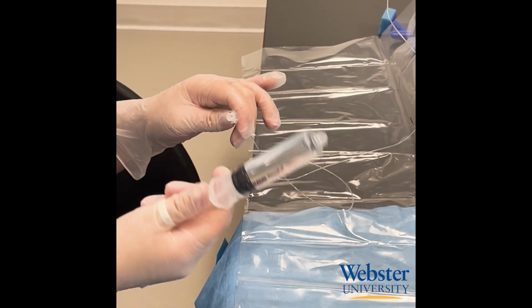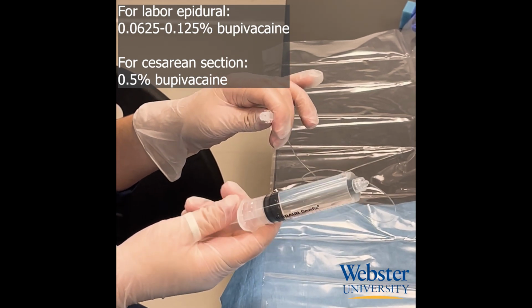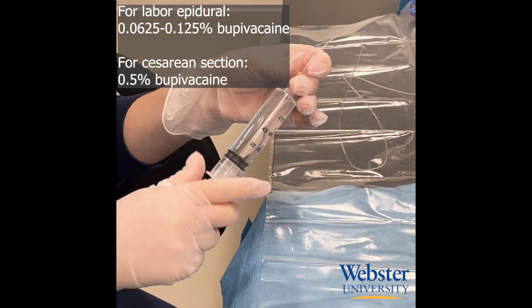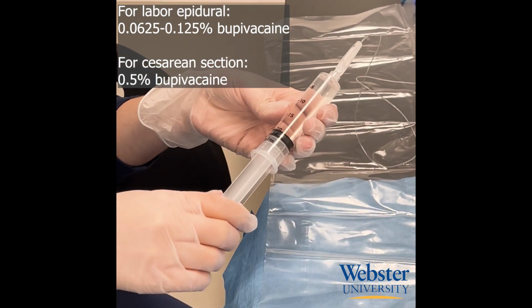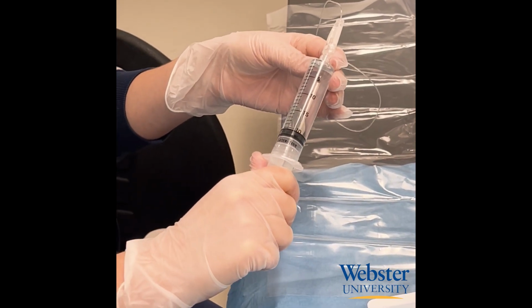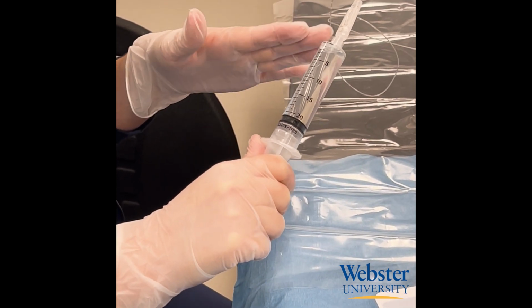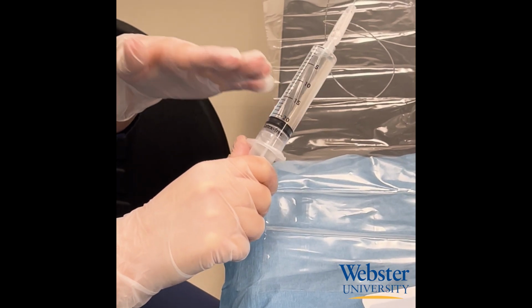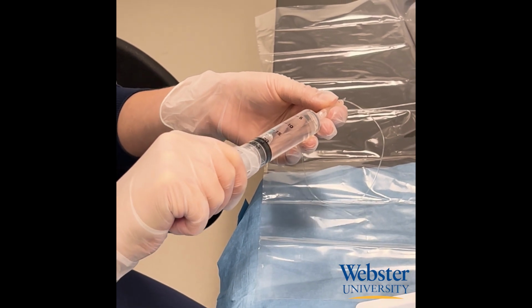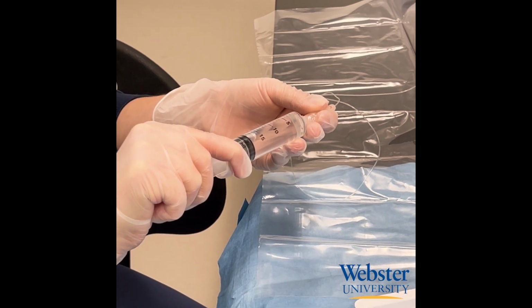To bolus the epidural, typically 0.0625% or 0.125% bupivacaine is used for labor, and 0.5% bupivacaine is used for cesarean section. You want to bolus very carefully, so even though you just tested the catheter, you still want to pull back and make sure there is no blood or CSF. As long as you don't see either of those, you can go ahead and bolus 5 mL. Since the catheter is long and small, there is significant resistance felt. That is normal.